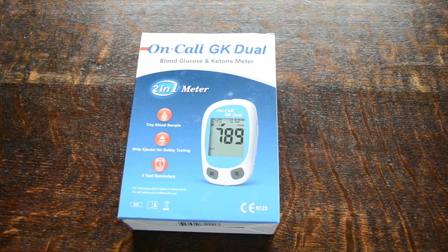We're going to talk briefly about this new meter system that we're importing for sale in the United Kingdom. It's been on sale for approximately three to four weeks and it's selling incredibly well. It's the On-Call GK — the GK stands for glucose ketones — so it's a dual function meter.